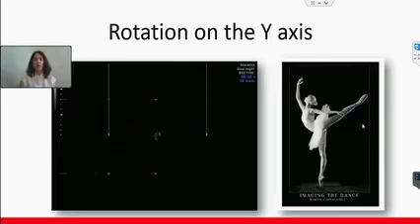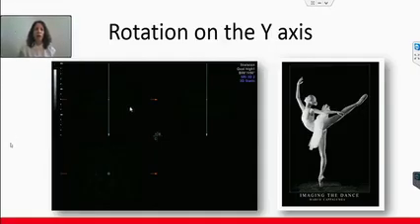Now, in order to understand what happens when you rotate one image, and how it influences the other image, I want you to think about this ballerina rotating on a point. Here I'm giving you a blank slate so you can use your imagination. You will need this ability to imagine in your daily work. So let's see how it works.